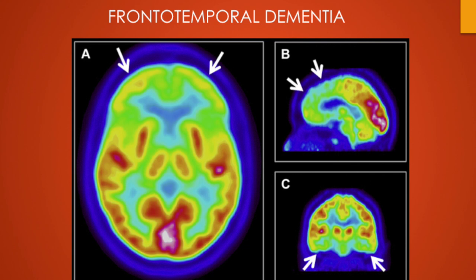In frontotemporal dementia, there is hypometabolism in the frontal cortex, anterior cingulum and anterolateral temporal cortex. The hypometabolism can also affect the caudate nuclei. The pattern of cortical hypometabolism may vary in different forms of frontotemporal dementia, but most importantly — as the name itself suggests — you have to focus on analyzing the frontal and temporal cortex.